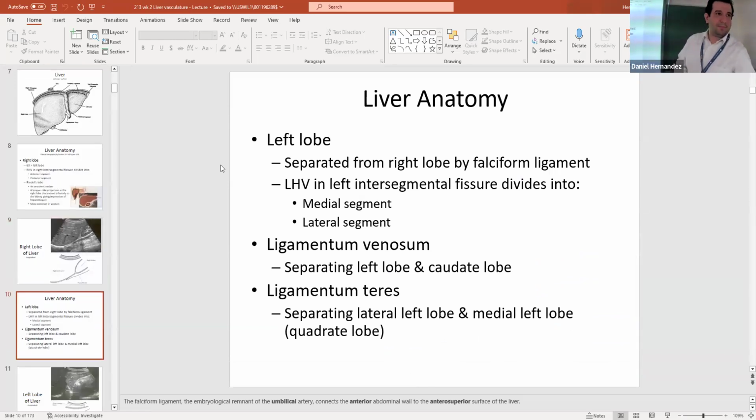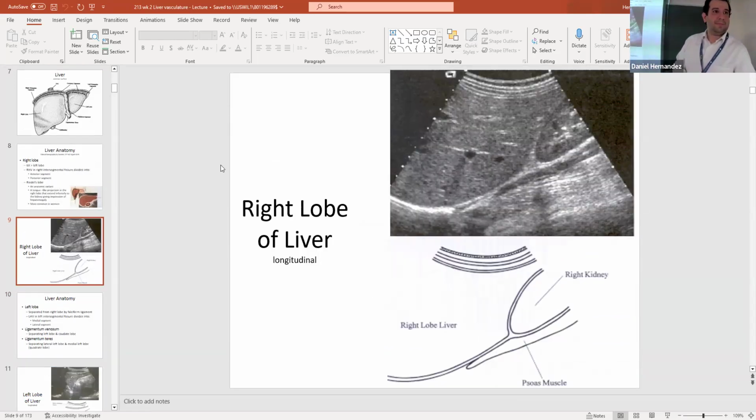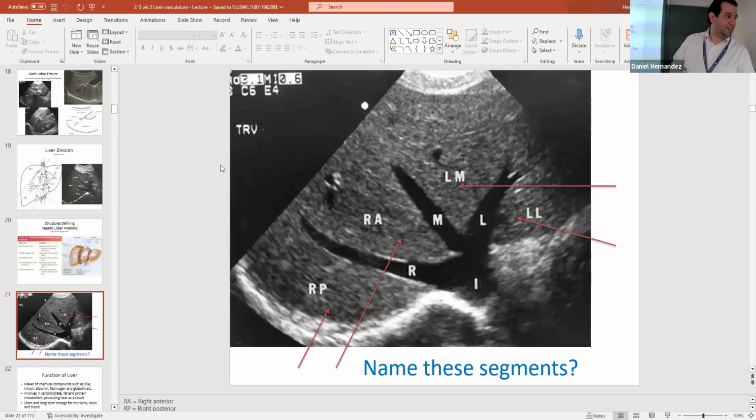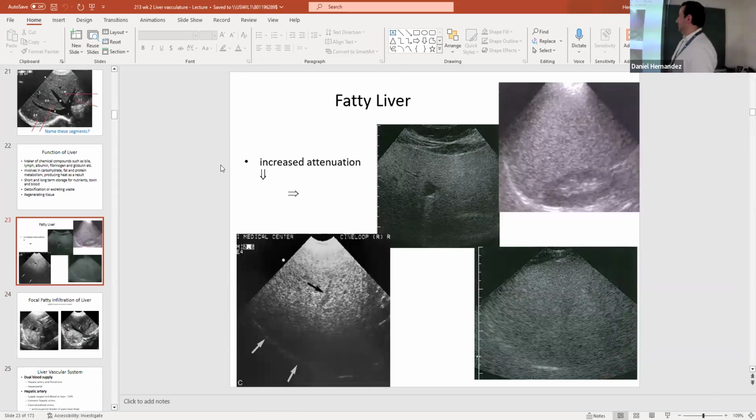Where I still have a hard time recognizing a fatty liver based on the pictures is when they say, all right, that liver is echogenic, and I think it looks isoechoic. I feel like a lot of them, if it's not really bad, I think they look a little bit more heterogeneous. I would write isoechoic on a lot of them. But those are obvious, right? Are they all fatty? Yeah, those are all fatty.